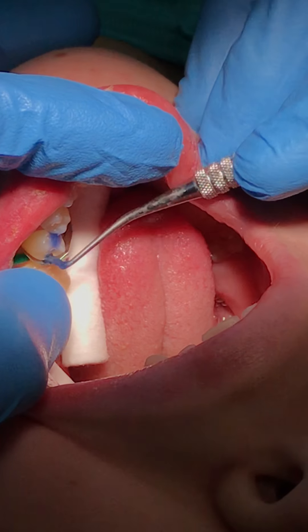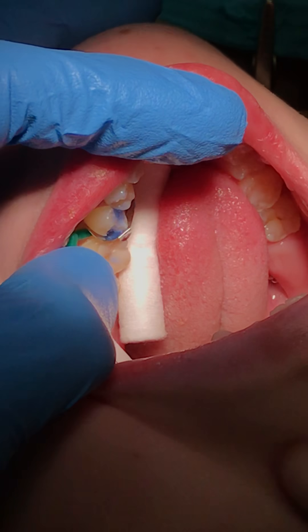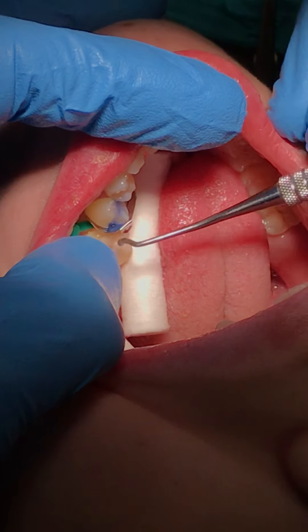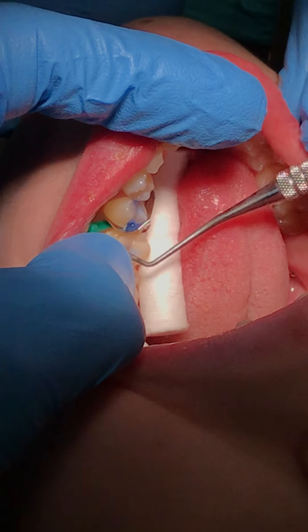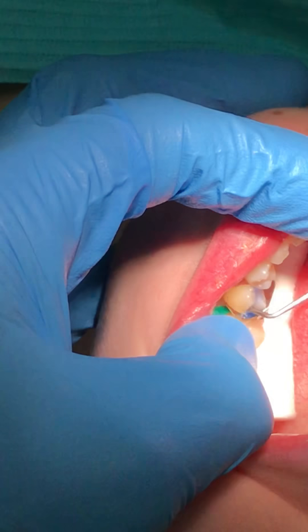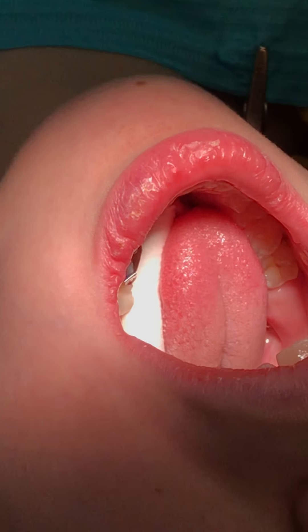I'm going to get that down here on the enamel. The dentin is kind of secondary — make sure though that carries this out. Whatever is on the dentin I leave it on there just for a shorter period of time, because most of the etching we want on the enamel.